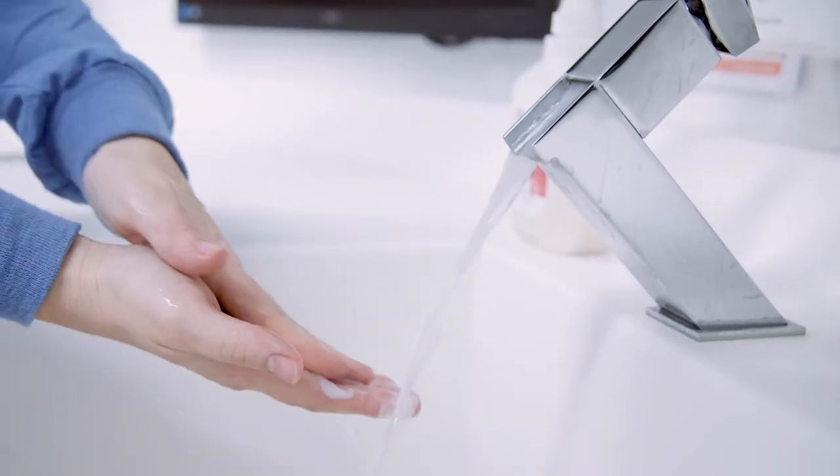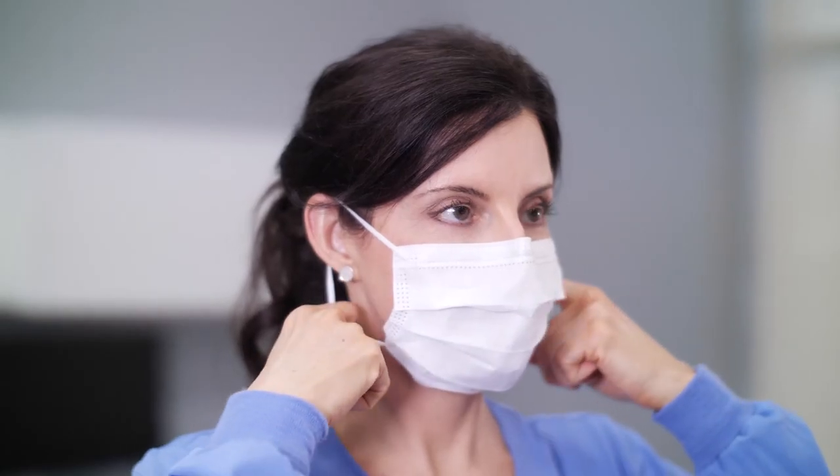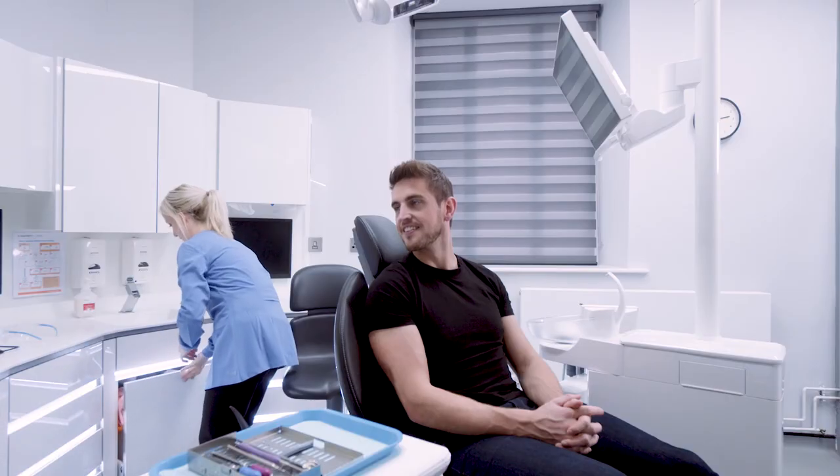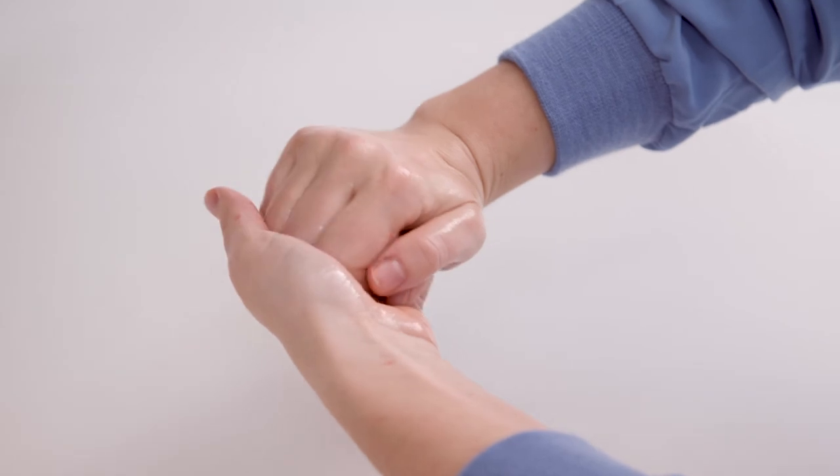Face masks should be changed between patients and when they are wet or visibly soiled. To properly remove a face mask, remove gloves and perform hand hygiene before touching the mask. Remove the face mask handling only the ear loops. Discard, and perform hand hygiene again.